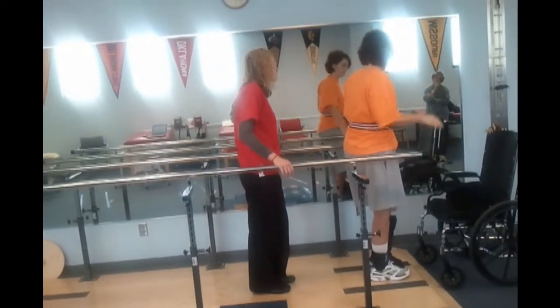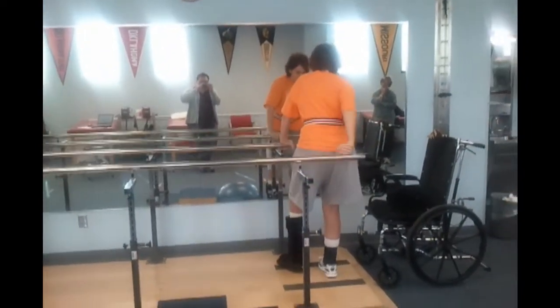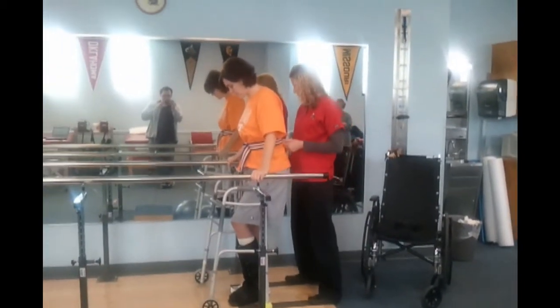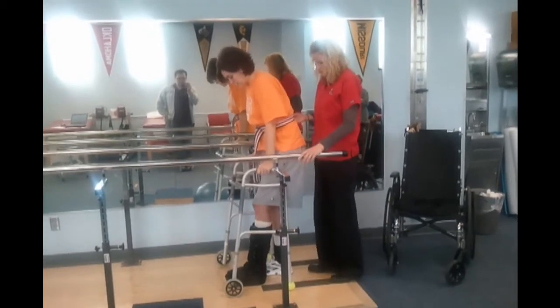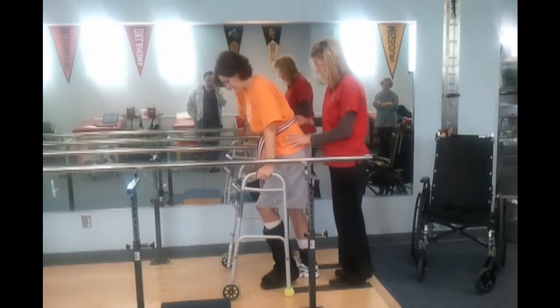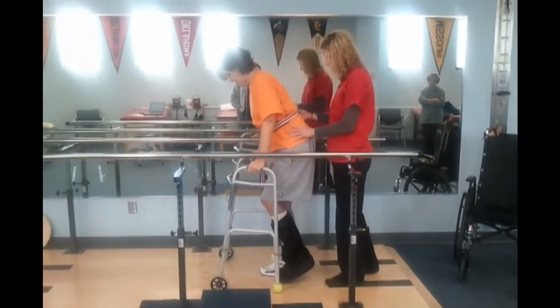We're going to stay in the bars with the walker at first, so I'll be right back. So, what do I do? Hands here. And then just press down and do just like what you were doing with the bars. Good. Good. Good. Look at you go.